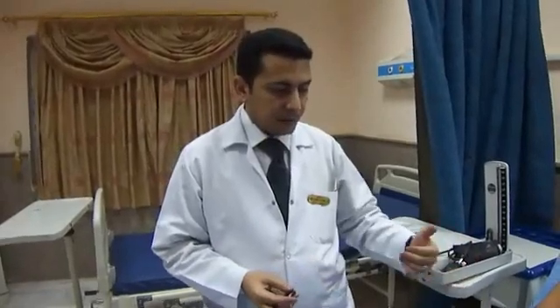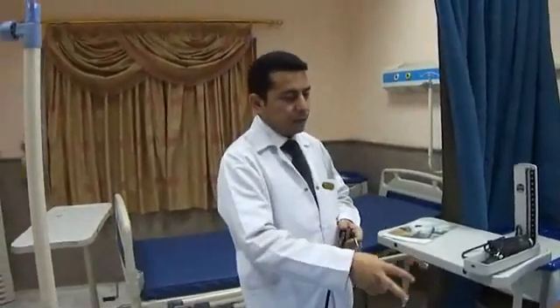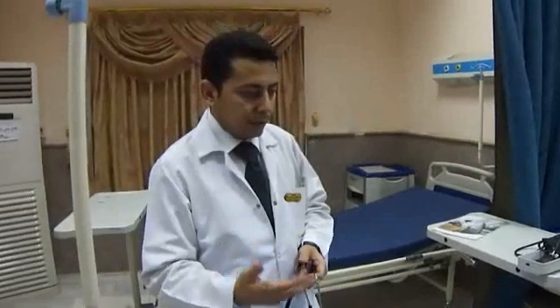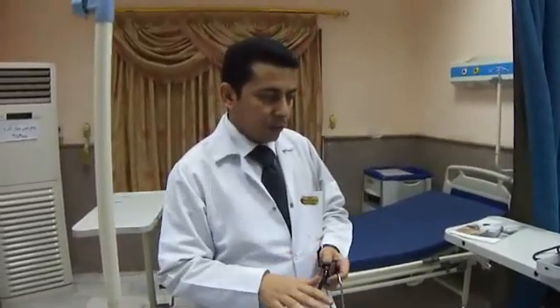The measurement should be repeated at the left side and the highest reading taken. For young patients, blood pressure should also be taken at the legs as well as the upper limbs. If the patient is suspected to have autonomic dysfunction, hypovolemia, or is elderly, one should also measure supine and standing blood pressure. These are all the key issues regarding blood pressure measurement.